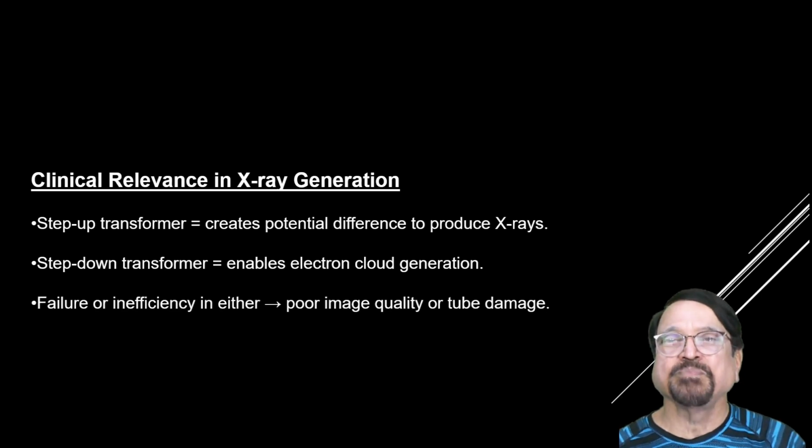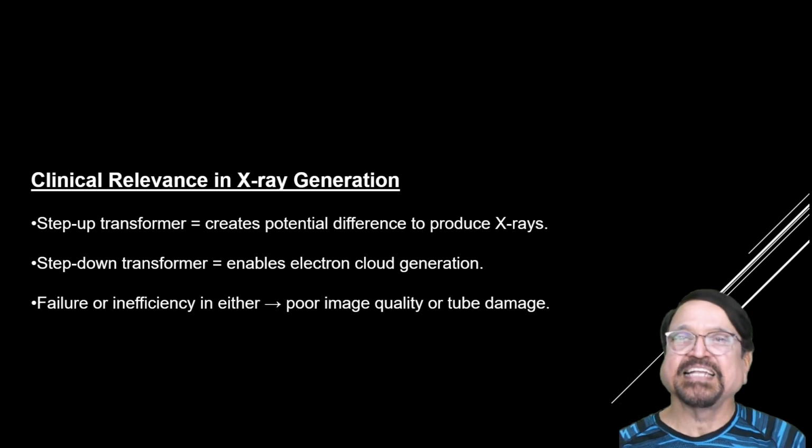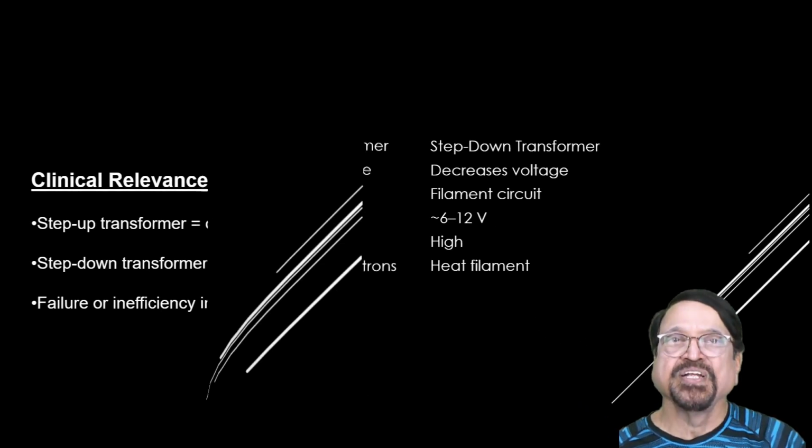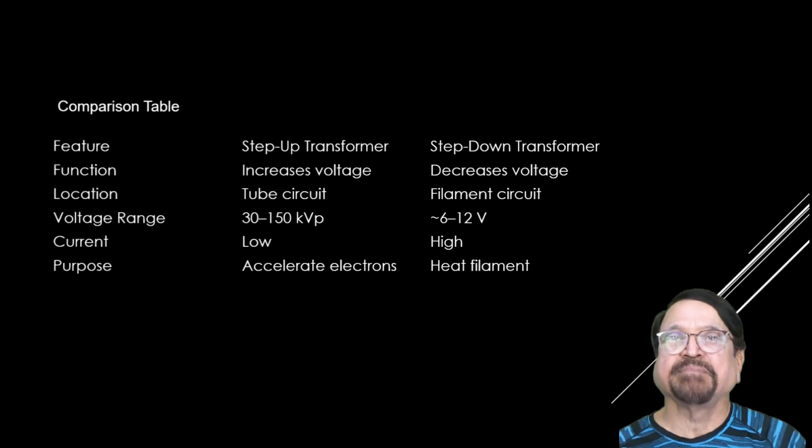So this is the most important. Failure or insufficiency in either step-up or step-down transformer will result in poor image quality, or tube damage can occur.